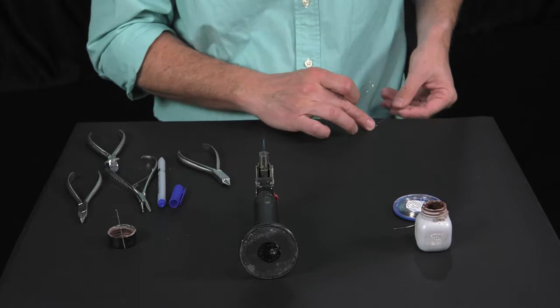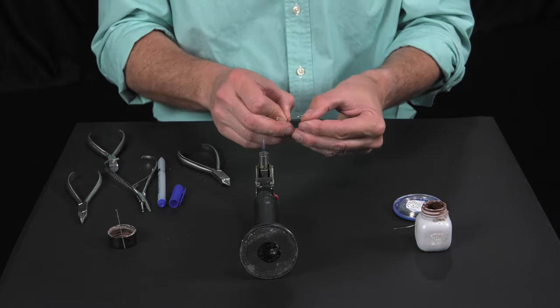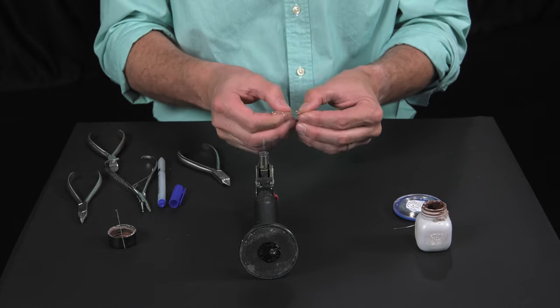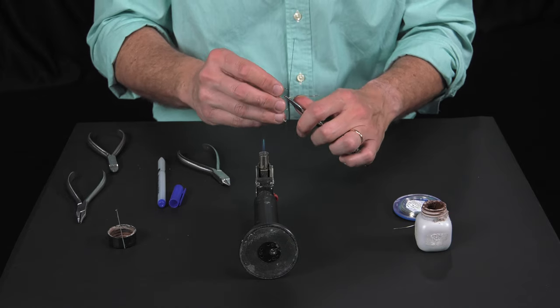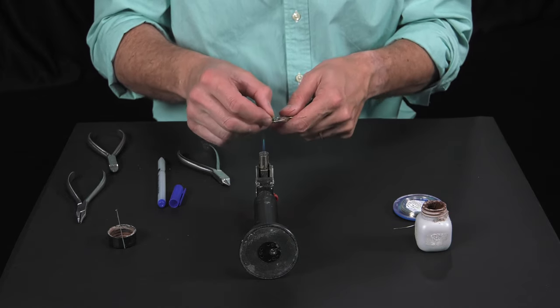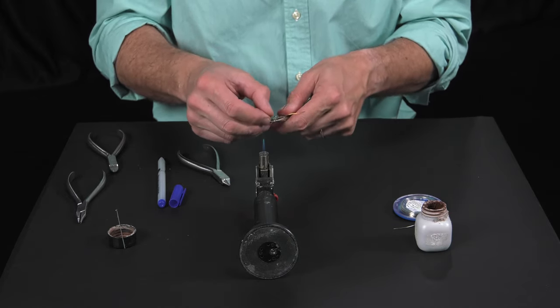It's very important now to stabilize the wire, and that the silver solder ball is placed exactly on the point where we want to perform the soldering.